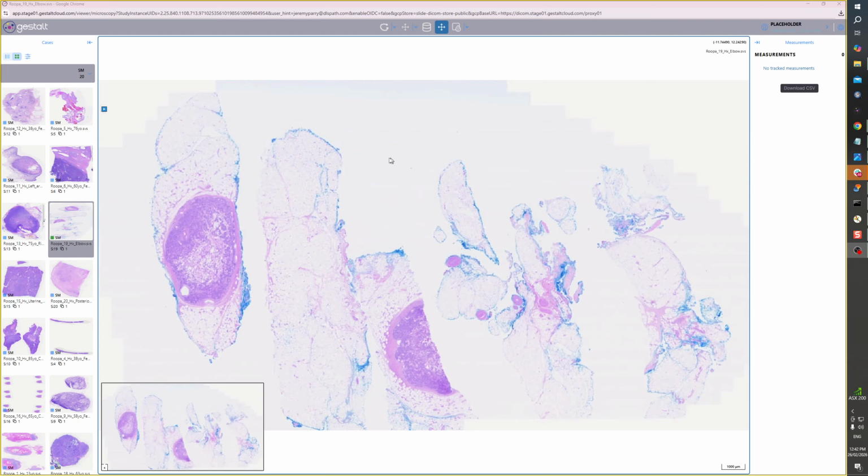I just want to focus on annotations today, and then we can do other tutorials about creating your own studies and uploading them and sharing them. But the way we've created it at the moment is if you received a link to this particular study, which is Rupert's exam, some of you may have seen it, this is what will open when you follow the link.